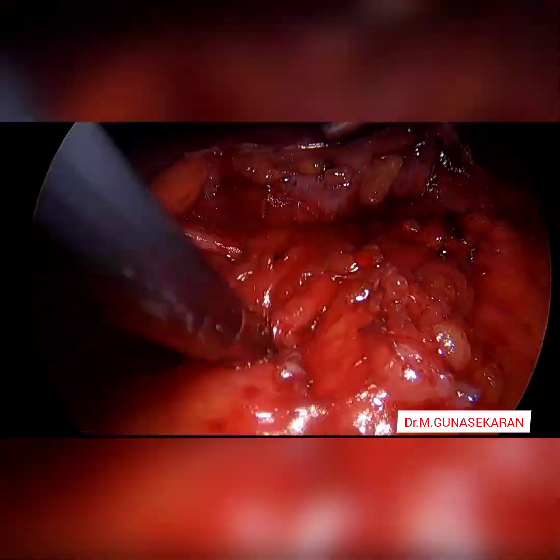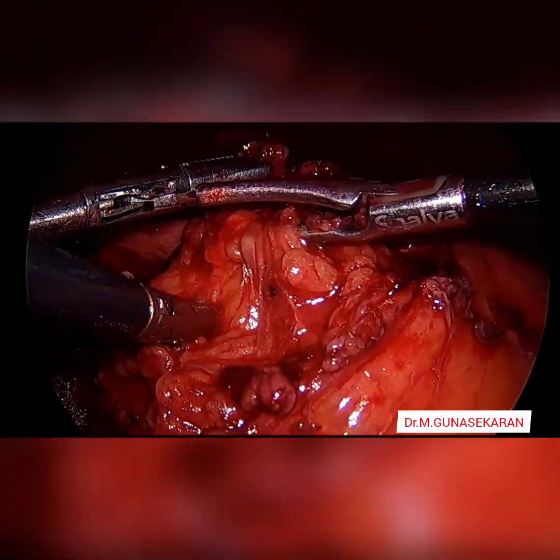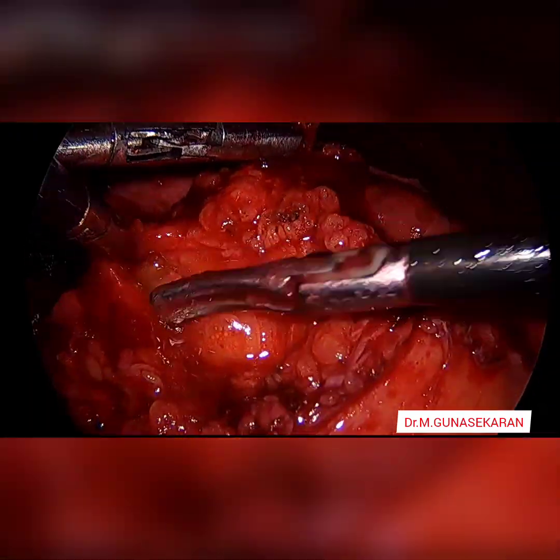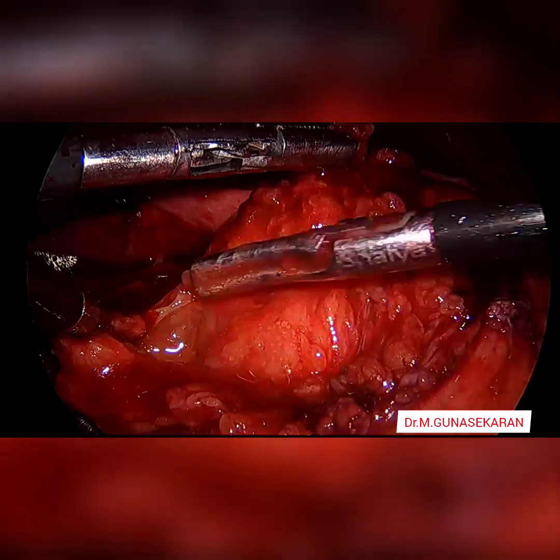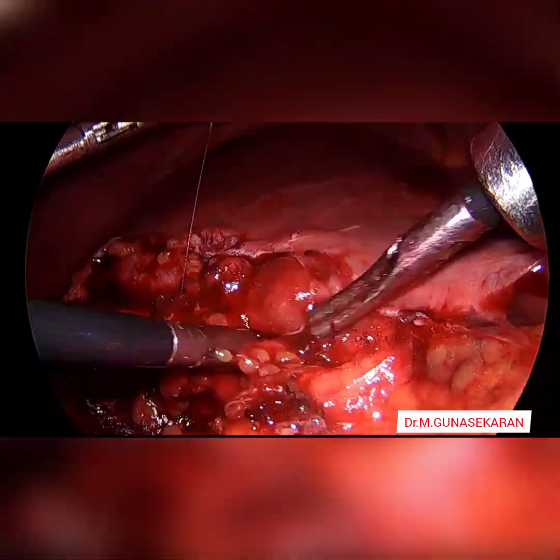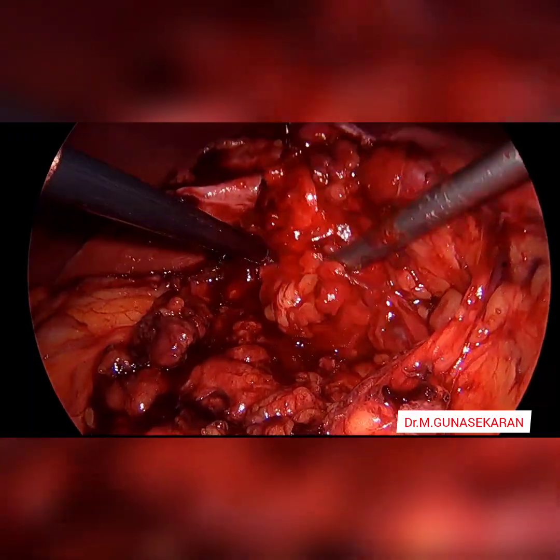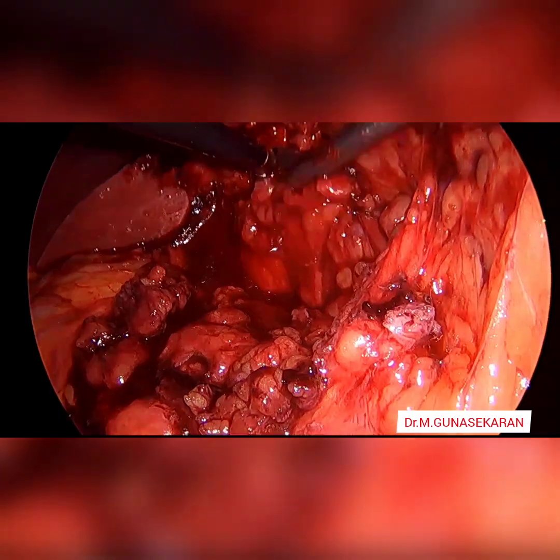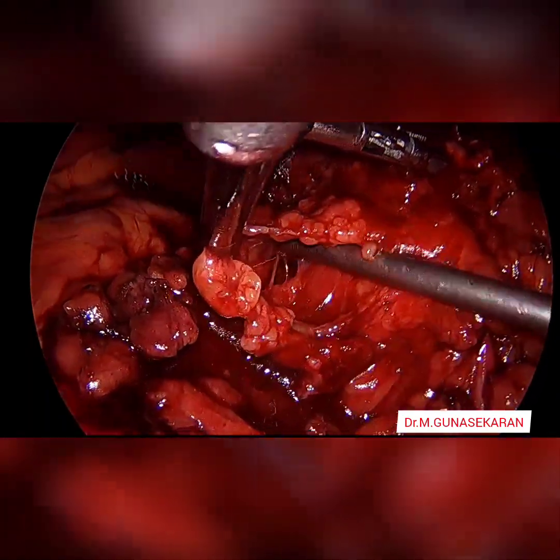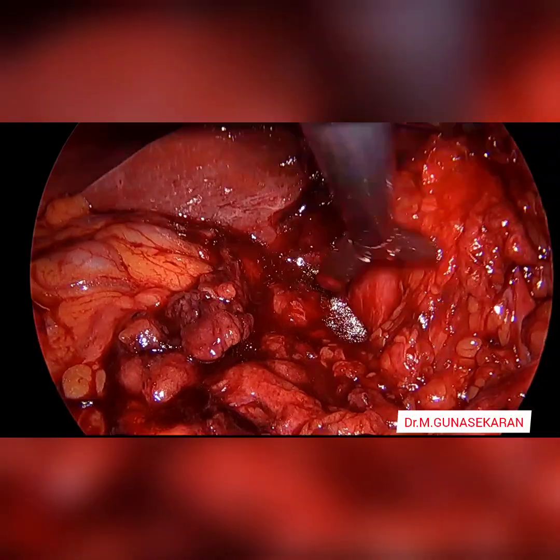Before proceeding, I want to see the wall of the gallbladder. Fiber by fiber, we have to dissect along the outer wall of the gallbladder, because this is the area where bowel adhesions are to be expected. Fortunately, there is a bowel here. I am now dissecting the adhesions from the gallbladder wall. Now I can see part of the wall, and I am creating a plane to dissect out the gallbladder after identifying its wall.